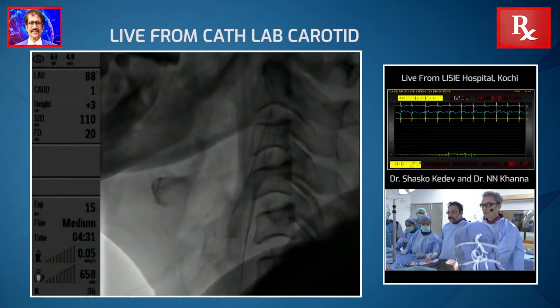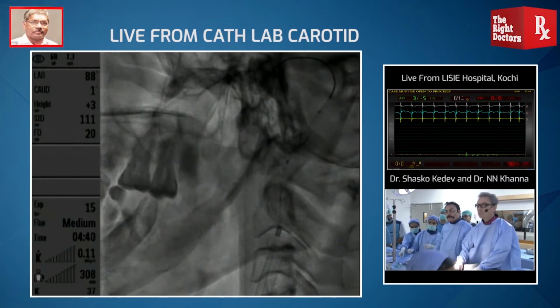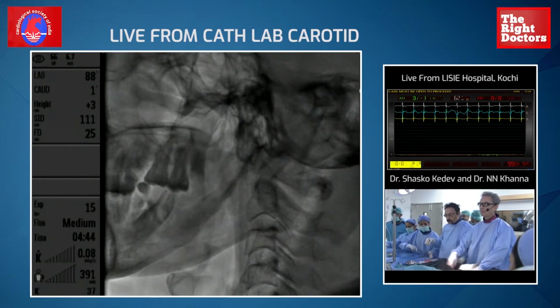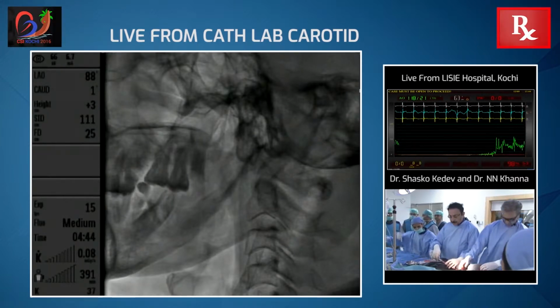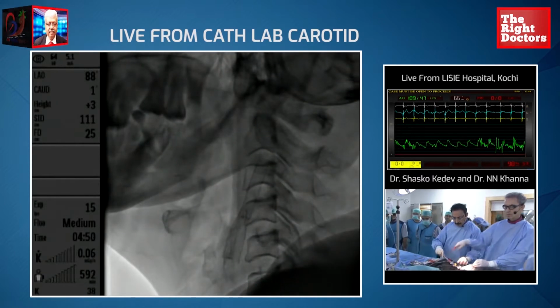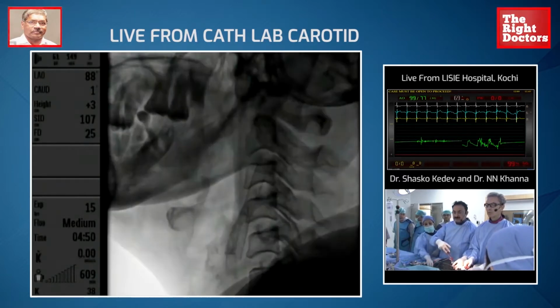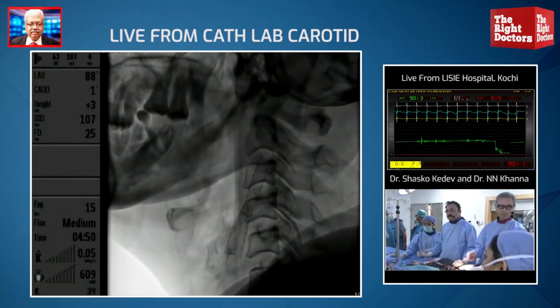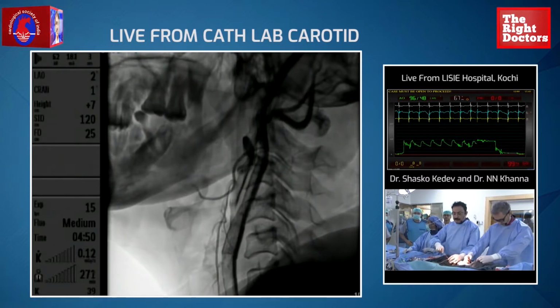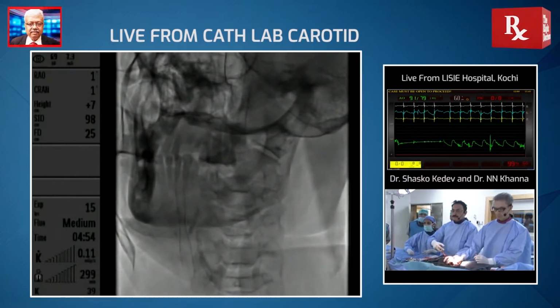No. Okay. Table, please. Table down. Please show me. Table down. Okay. You had a distal stenosis as well. Do you have any plan about that? About what? Which stenosis? Table, please. In the angiography, we go. Okay. So we are fine here. Okay, AP. So it's perfect expansion. And the size is fine also. Just 1 second.